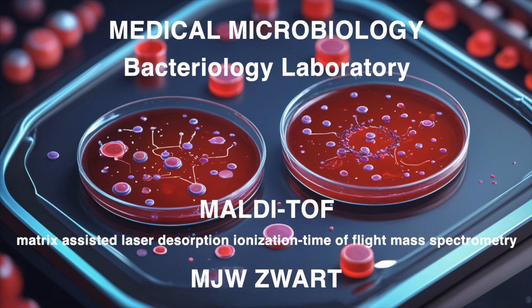So speaking of the process, our listeners' sources lay out a really detailed workflow for the Microflex. Where do we even begin with this whole thing? Well, before you even think about analyzing samples, you have to make sure the Microflex is up to snuff, working properly. Right, exactly. That's where daily validation comes in. And the star of the show for this is what they call the Bacterial Test Standard, or BTS.